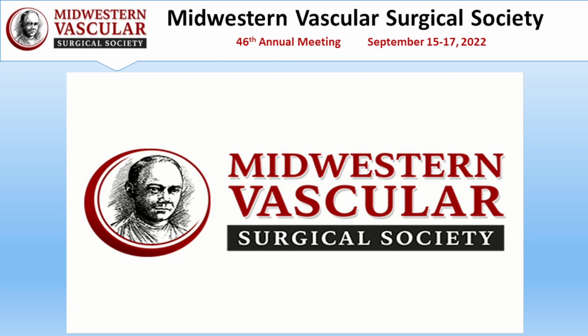Thank you very much for a challenging case. I have one question. Do you know by any chance how much contrast was used, and would you consider doing this under CO2 angiography? We used minimal contrast. His creatinine was 1.6. I think we completed the whole procedure with less than 40 to 60, I believe, cc's.